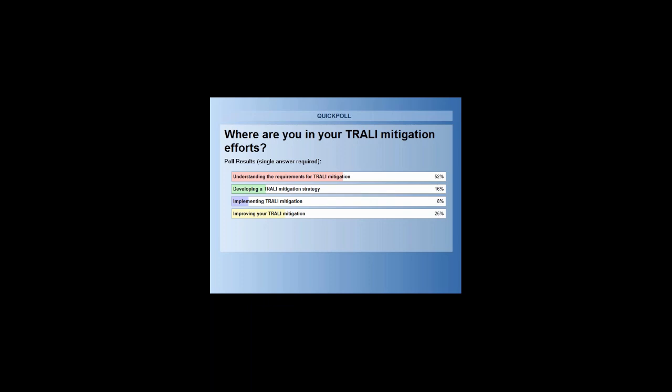for HNA antibodies. And according to the created sample list, the Luminex batch is pipetted by the technicians, and after confirming the results by Fusion software, the results are sent from Luminex to the information system of our blood bank, and results are allocated to the product number, to the results for HLA class 1, HLA class 2, and HNA antibodies. And then if we have positive results, the donor is excluded from the donation of FFP and platelet apheresis. Is it okay for you? Okay, great.